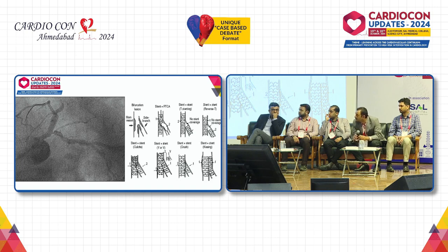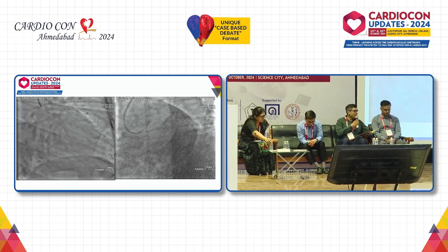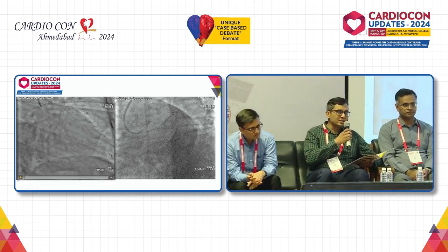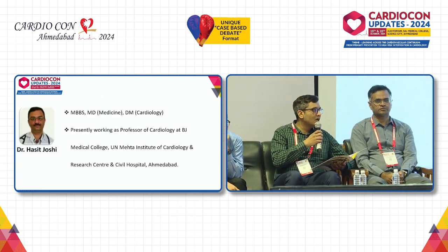Like in our case, the patient is having restenosis at the ostial LCX. So from your talk, if the angle is less than 70, or the lesion is more than 10 millimeter, or a fibrocalcific lesion, then reverse crush is necessary.